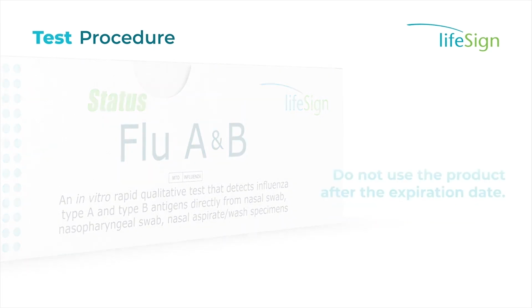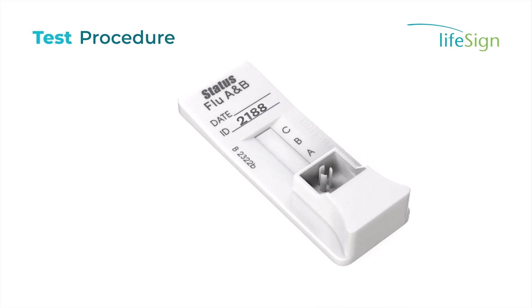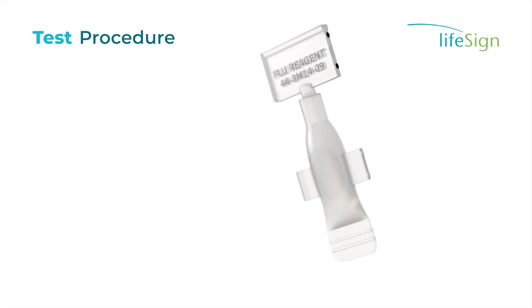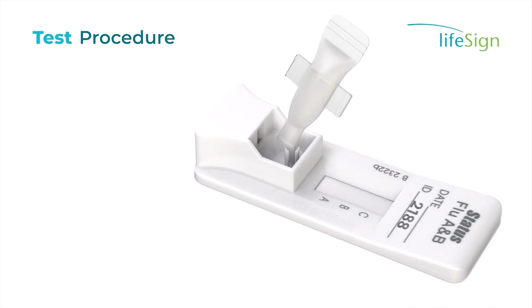Once the patient's swab has been collected, open the foil pouch, place the cassette on a level surface, and label the cassette with a patient identification. Remove 1 extraction reagent capsule from the strip and tear off the tab to open. Squeeze the reagent capsule to dispense all of the reagent into the extraction well of the test cassette.